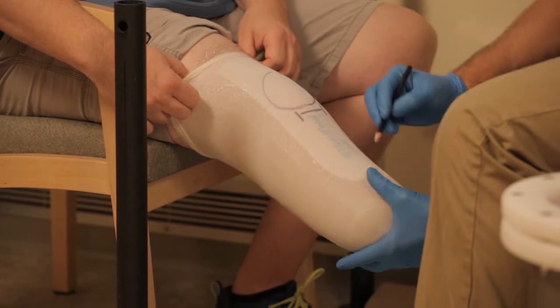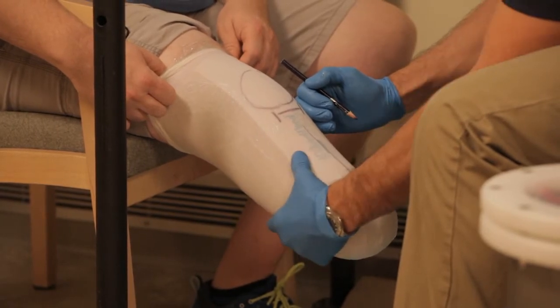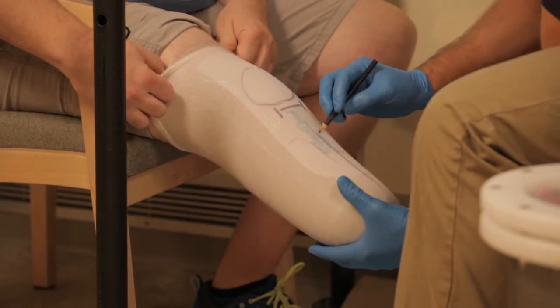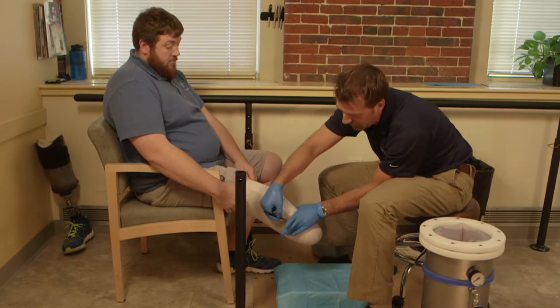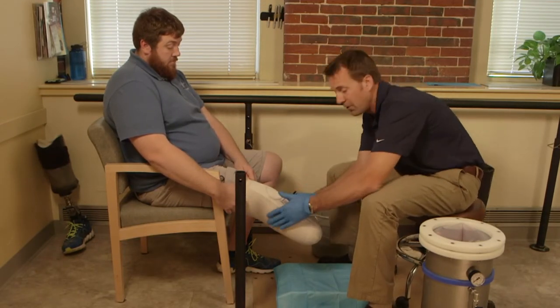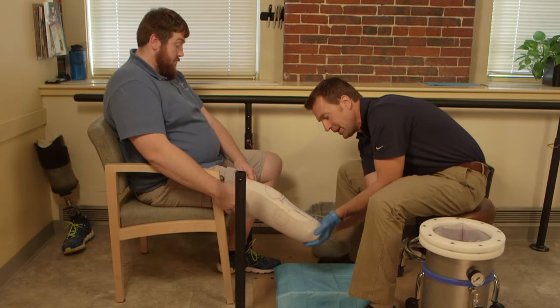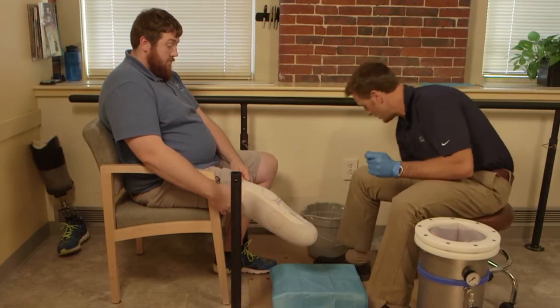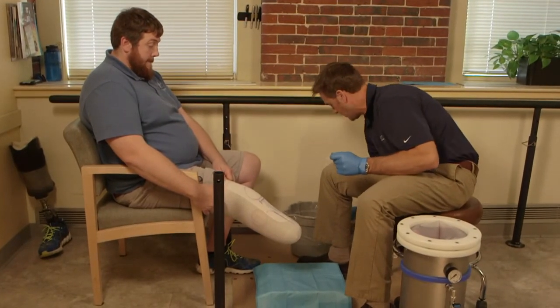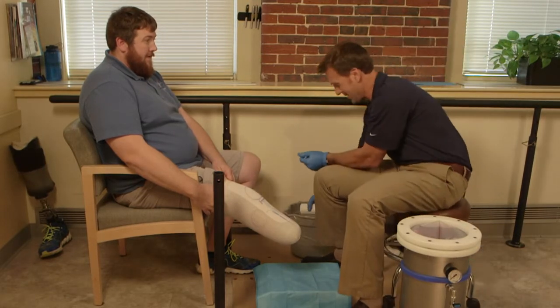This system can be used with a brand new amputee or someone who is a seasoned or veteran amputee who may need a replacement socket. The one requirement is that the individual is able to actually stand up under their own power for a total of about five minutes. Sometimes with new amputees who have not gone through rehab yet, we may choose to do the traditional hand cast method with them seated. But my model today is an active amputee and we'll be able to perform this task quite easily.